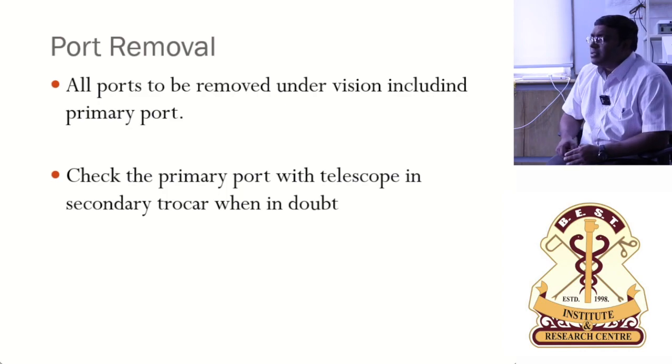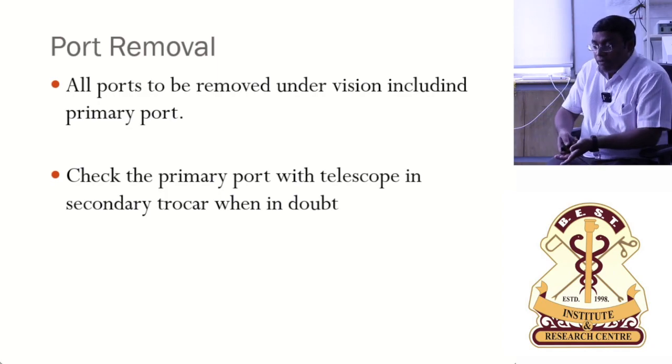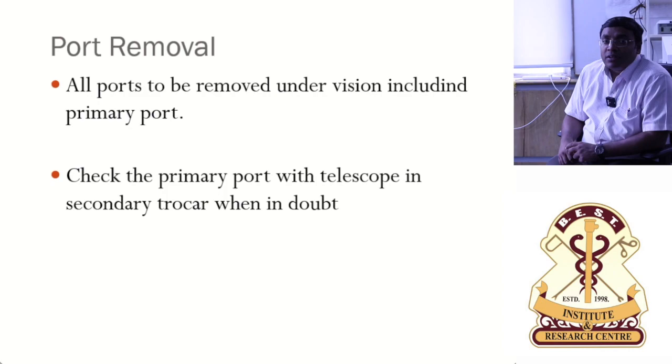That we achieve, that is not the thing. I am talking about releasing the pneumoperitoneum and removal of the trocars. See the bowel loops. Yes. So when you are removing the optical trocar after the entire pneumoperitoneum is released, you have to tent up the telescope and then under vision you take it out. Then one more thing.